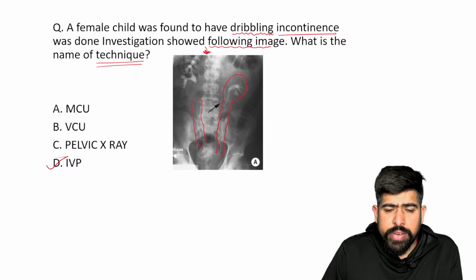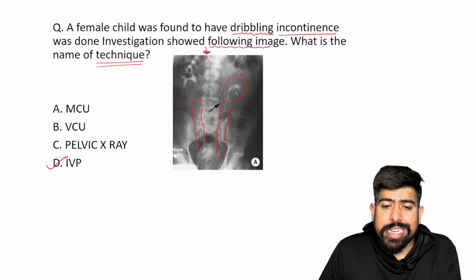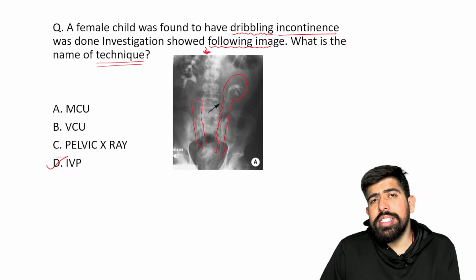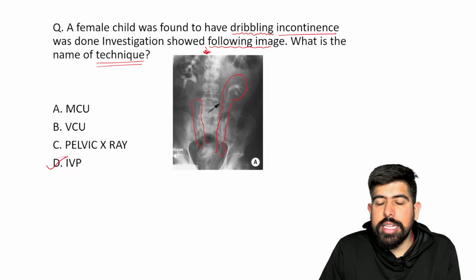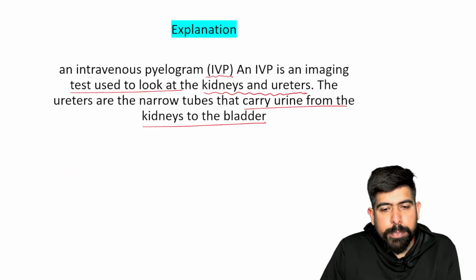For the later investigation, for seeing the kidney and ureters, we are doing this. Also, we can use the USG, but on the USG the visibility will not be there. But if any obstruction is there, that will be clearly visible to us, right? So this is about your intravenous pyelogram.